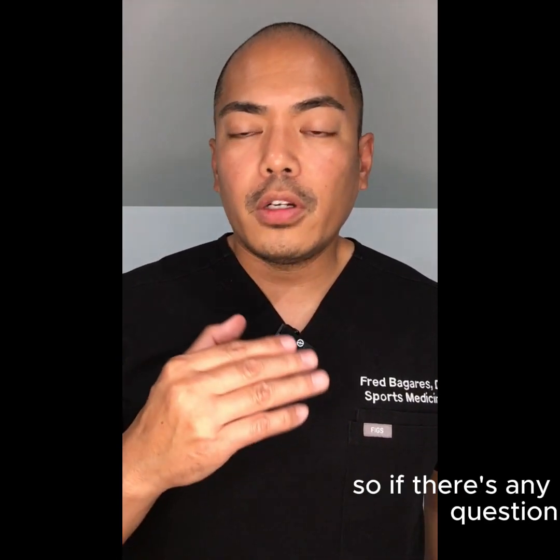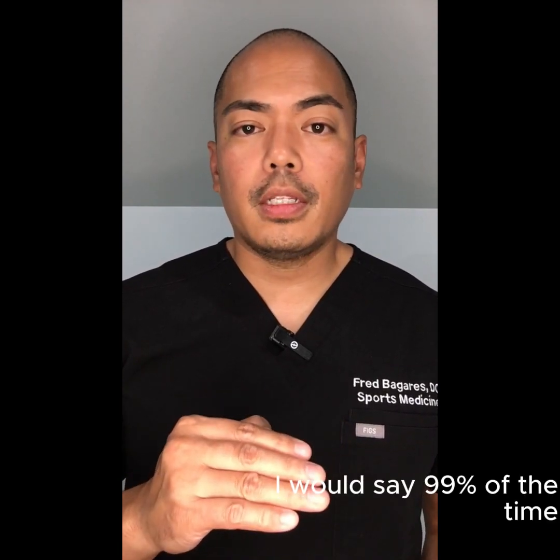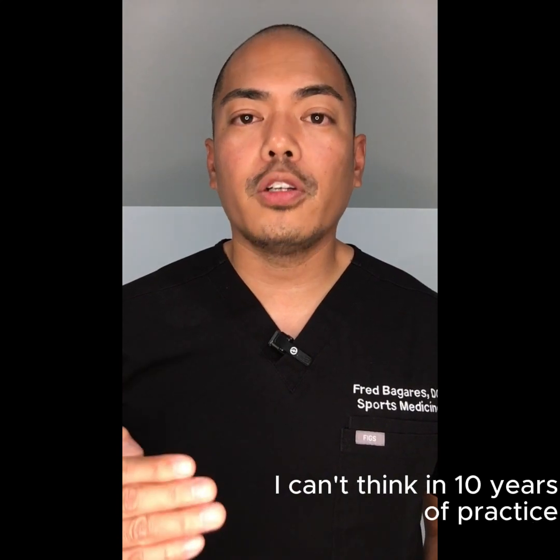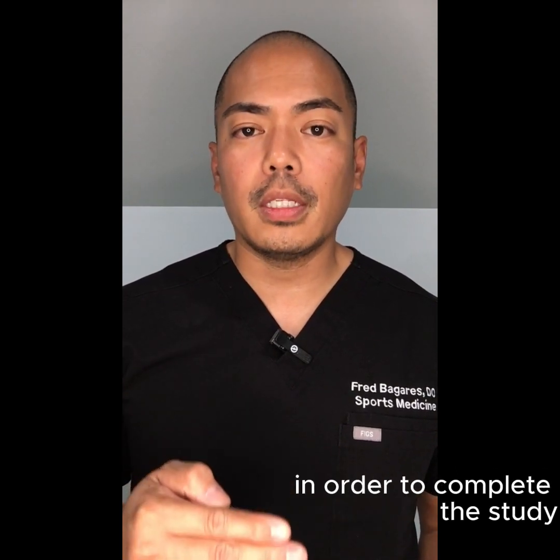So if there's any question or you can sense that the patient is wanting to stop taking anything, I would say 99% of the time, they can just continue taking everything. I can't think in 10 years of practice of a single time where I told the patient not to take a medication in order to complete the study.